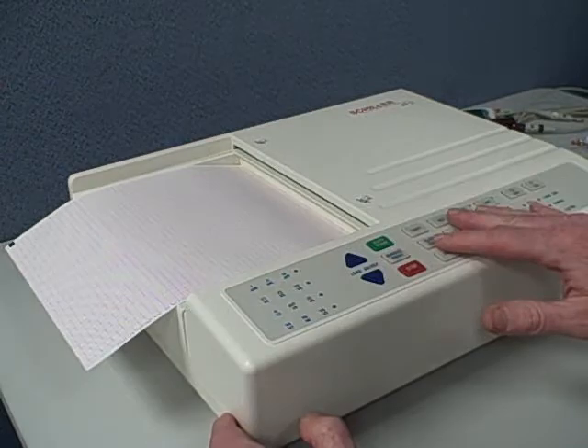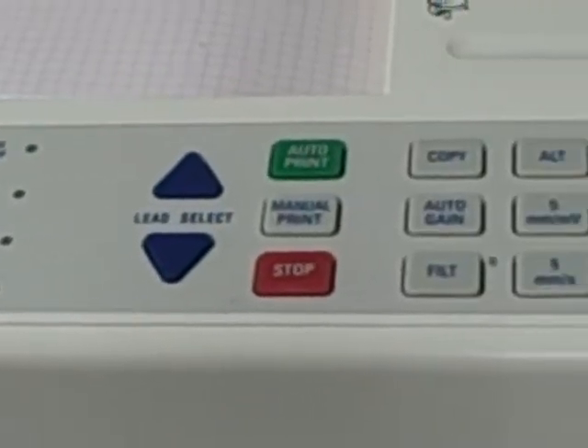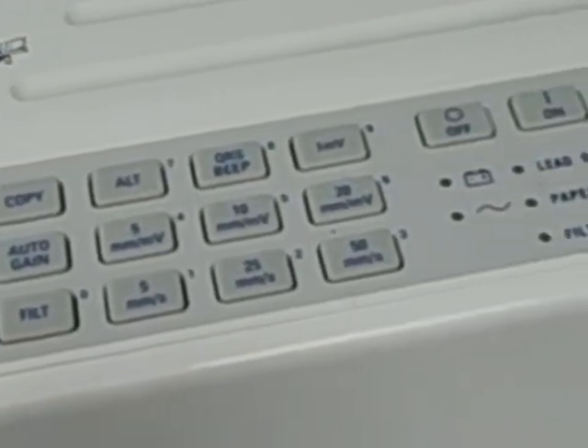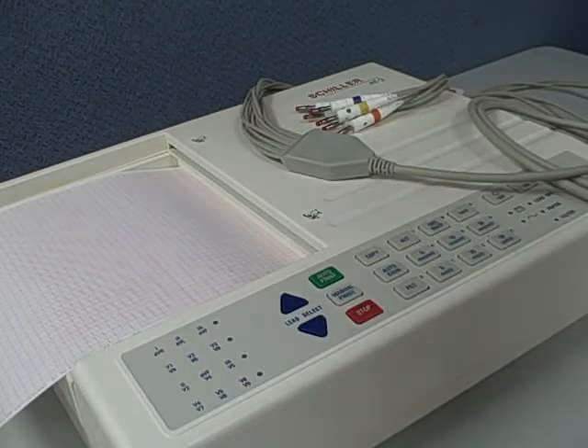It does not have an alphanumeric keyboard but has various function keys to make it easy to operate the machine. This model has been around for about 10 years in its current form. It's been a real workhorse for Schiller.